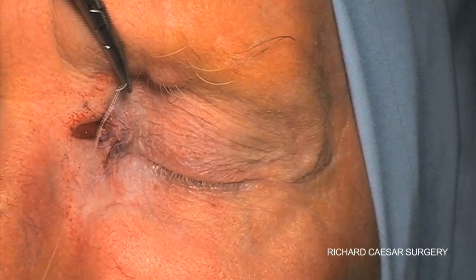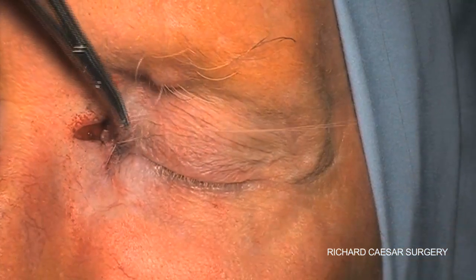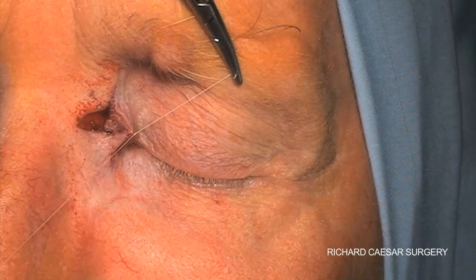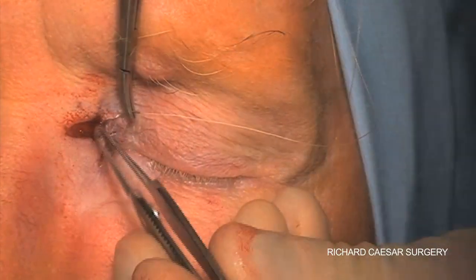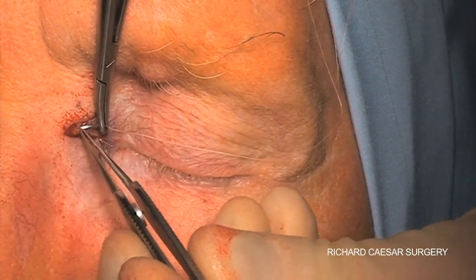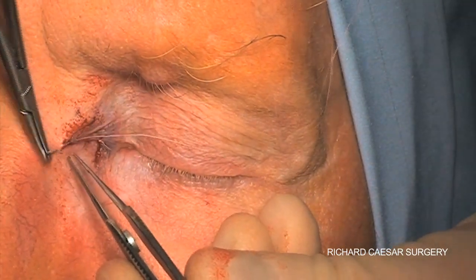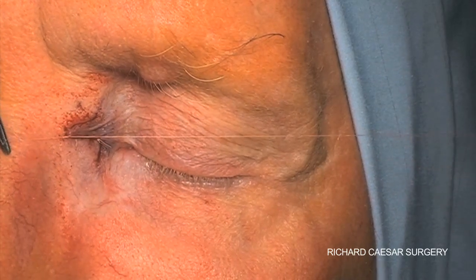I'm using a 6-0 vicryl suture, although I typically still remove these at a week rather than leaving them to dissolve. And with these two cardinal sutures in place, the rest of the Z can be put back together with a running stitch.